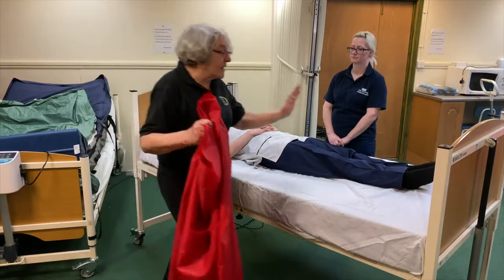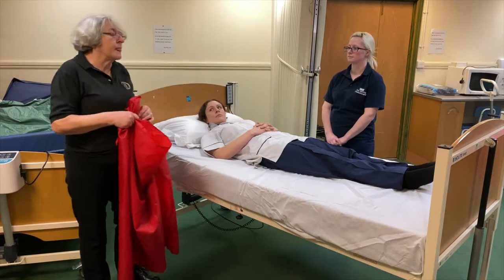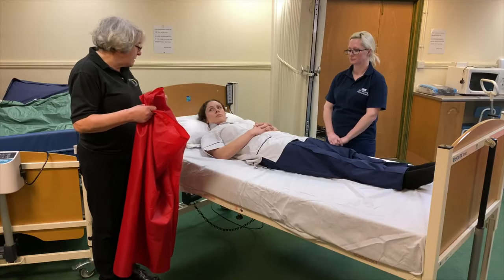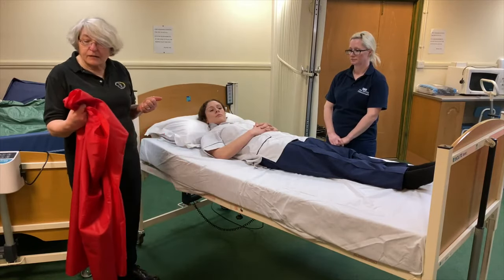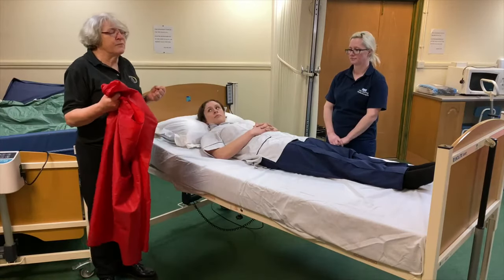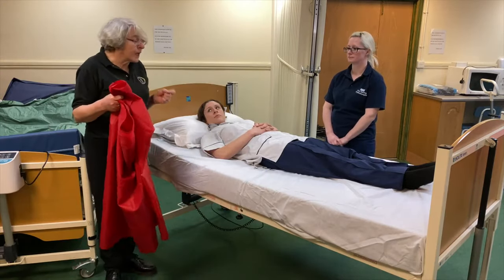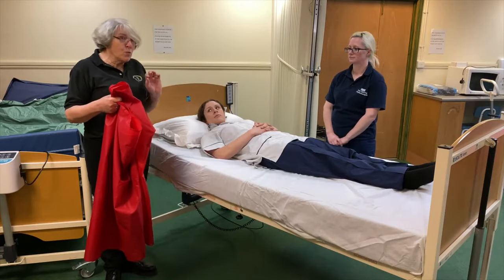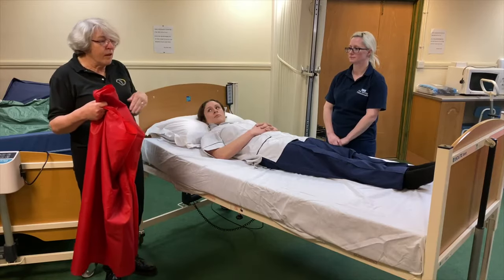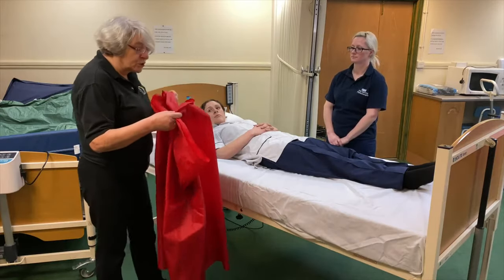We must always have a slide sheet under the heels, and the staff you work with will tell you about the importance of looking after heels. We do have to remember, for all our tissue viability aspects, moving and handling can't work without working in conjunction with tissue viability. And the best way to prevent tissue viability issues is to move people, so therefore we work together. So, I'm going to show you one method today of putting a slide sheet in. There is another commonly used method, but the staff that you're working with will show you that.